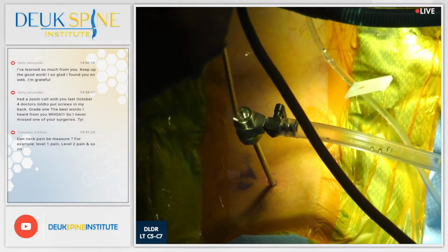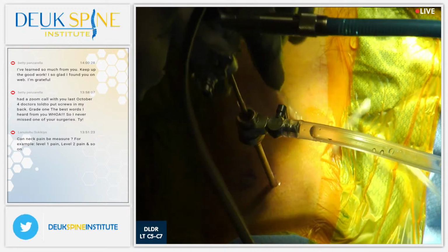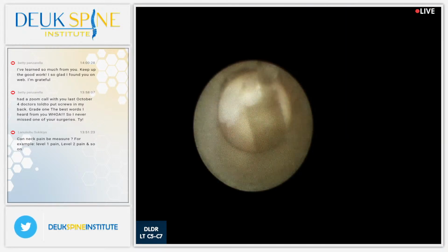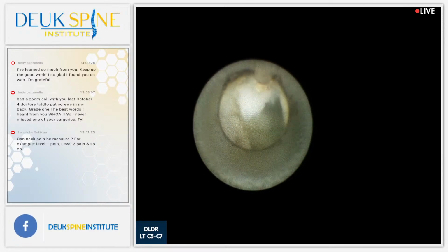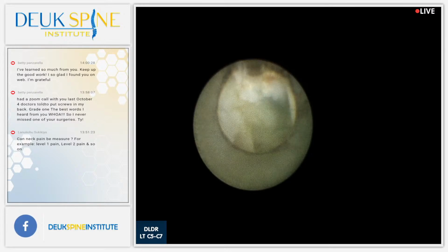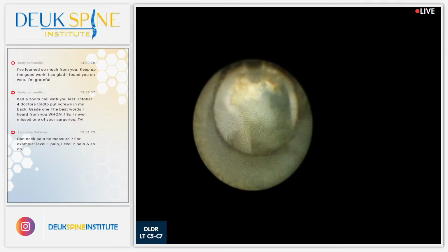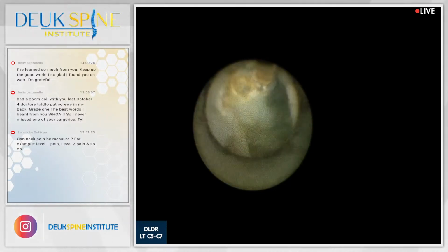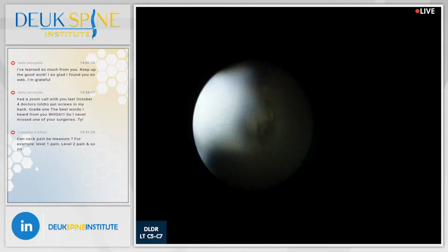Now, we have a name for that. And since I pioneered this technology, I get to name a lot of things because I'm the first person to see a lot of things in the world, since I'm one of the first in the world to do this. There's another. We call this a reverse herniation. So that piece of disc material I'm zapping right now used to be inside the tube area, but it shot out in the tear.